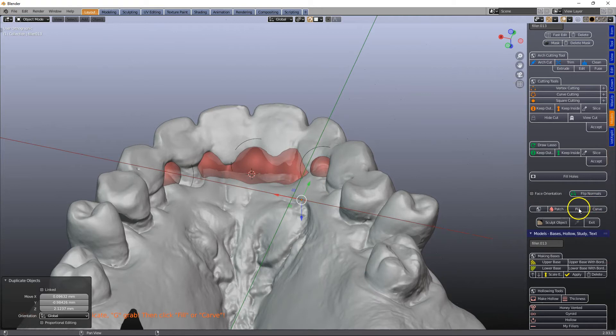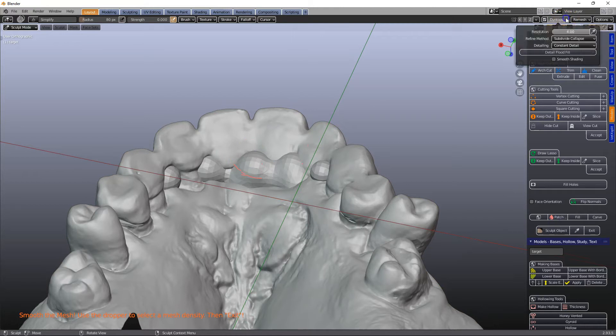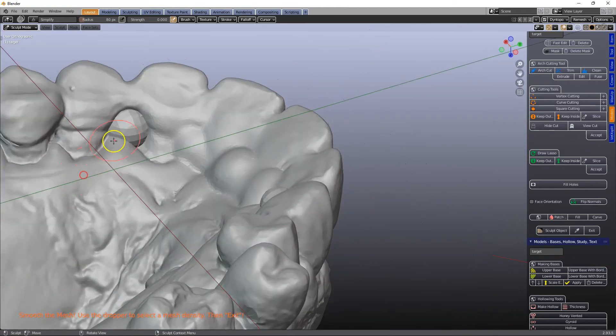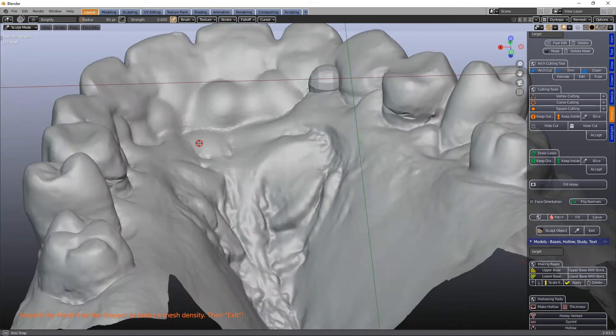Hit the fill button, go to Sculpt Objects. I'll put this a little bit less, maybe on two, and we'll just give it a quick smooth over like that. That's perfect.